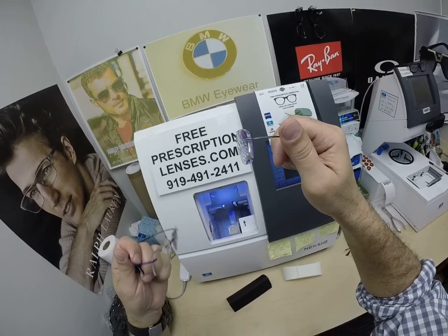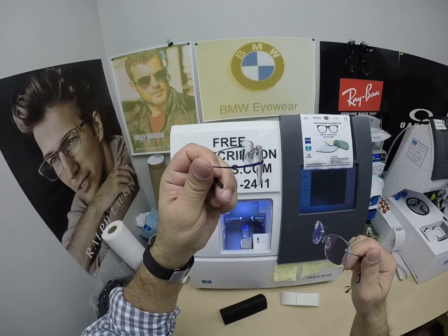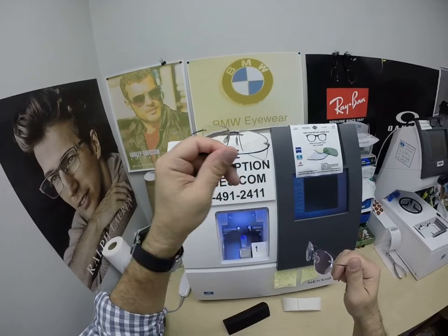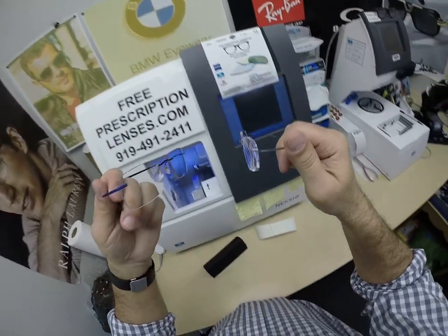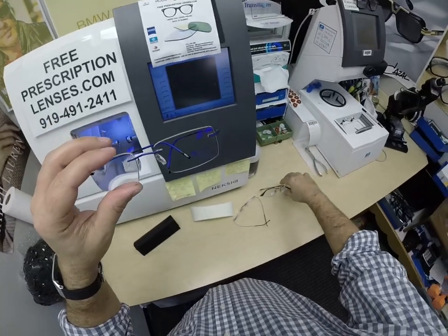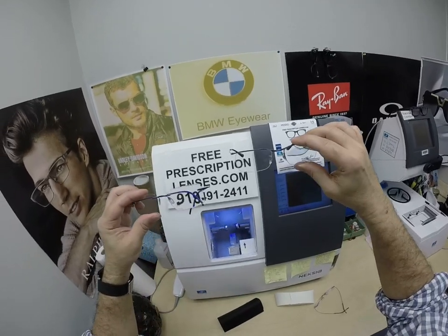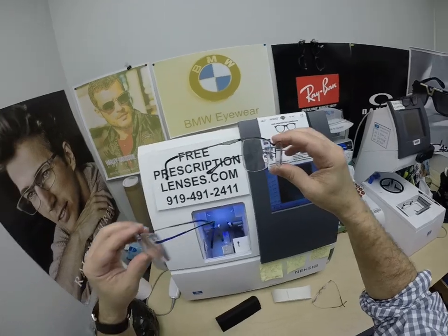But if you've been wearing polished edges and it doesn't bother you, I'll do it for you for free. If you haven't gotten it yet and you're not sure, I'd recommend getting the non-polished look. How many people are looking at the side of your head or the edge of your lenses? That's something to consider in a full rimless frame such as the Silhouette drill mount or a semi-rimless frame — you can opt for polished or non-polished.